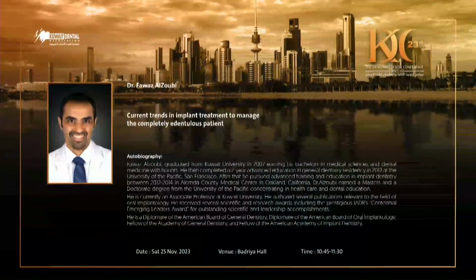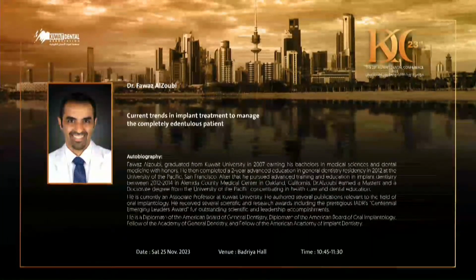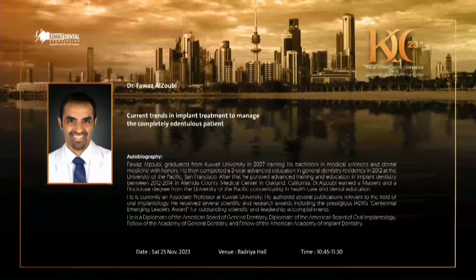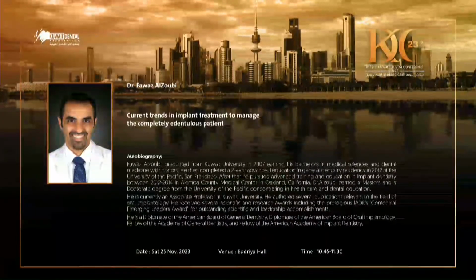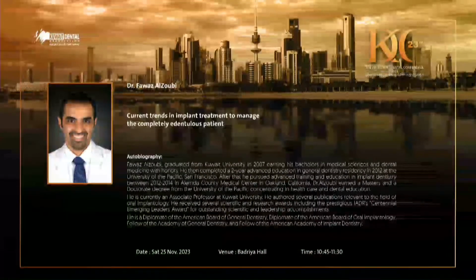Yeah. Okay. The second question, sorry. Do you have any experience with the 3-on-6 prosthesis or 3-on-6 concept? No. When we use only crowns and section them, some of the doctors are doing it instead of doing a full all-on-6 or all-on-4 without bone reduction. Did you have any problems with breakage of the crowns themselves? I'm sorry to say I have no experience with that, so I can't really provide any feedback.